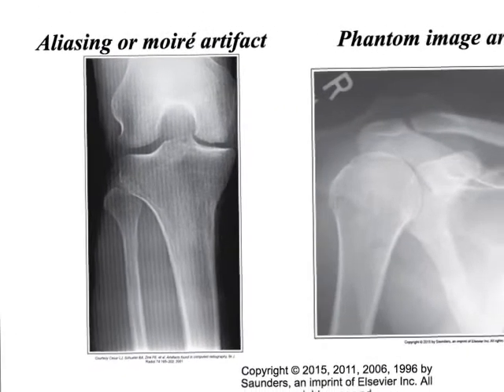Has anyone ever seen that? You've seen it? Grid artifact. Really seen on portables. This is only going to be a stationary grid.